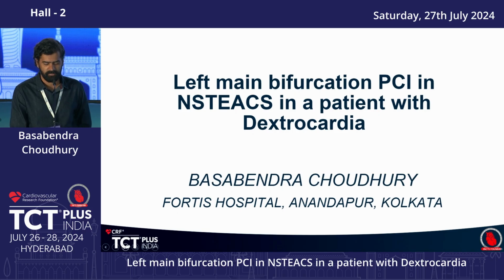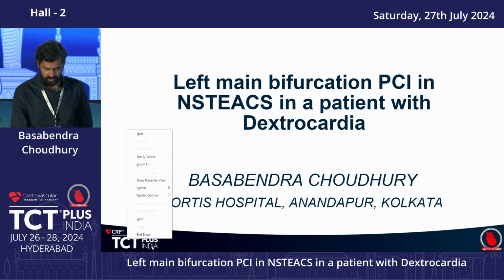This is a case of left main bifurcation stenting in a patient who presented with acute onset chest pain, who was diagnosed as NSTEMI, and he had dextrocardia.